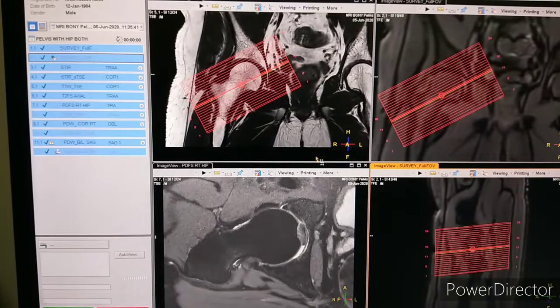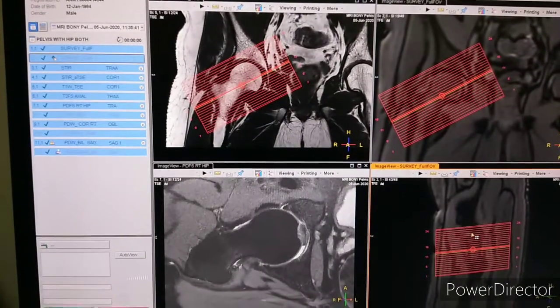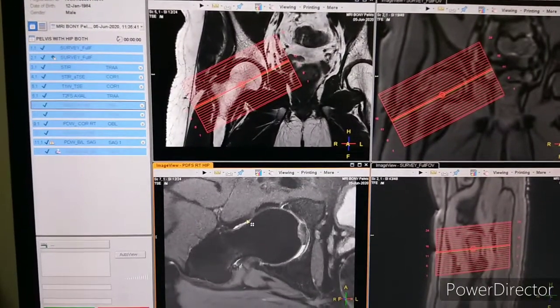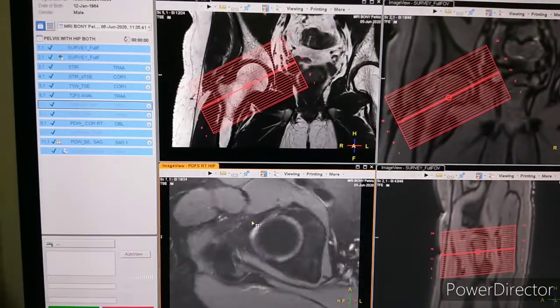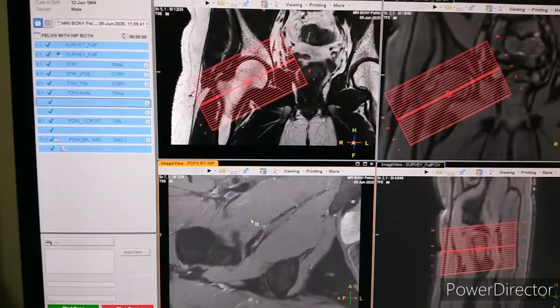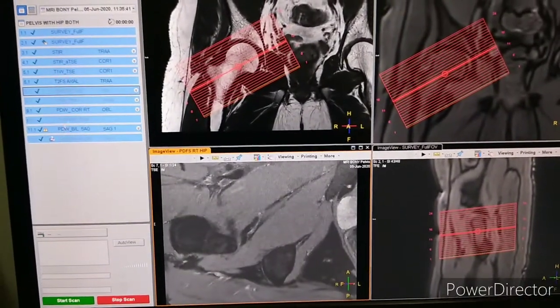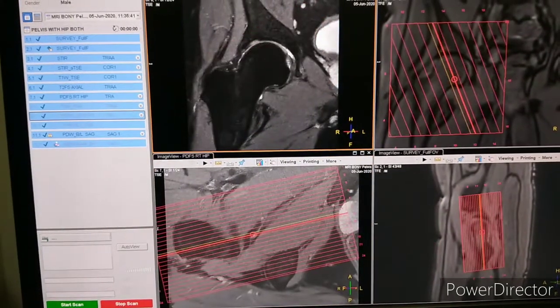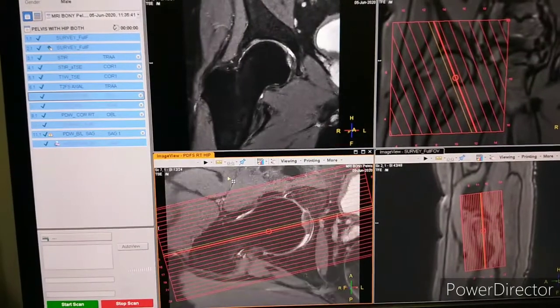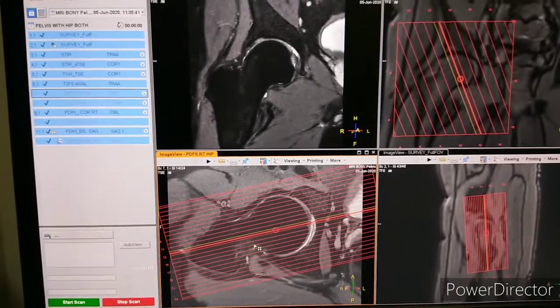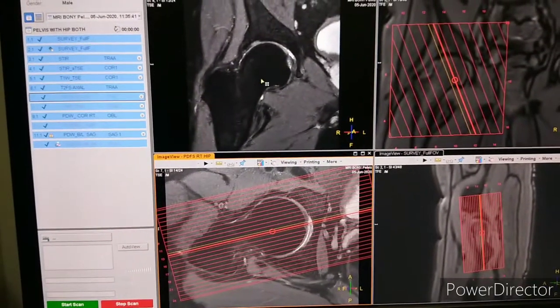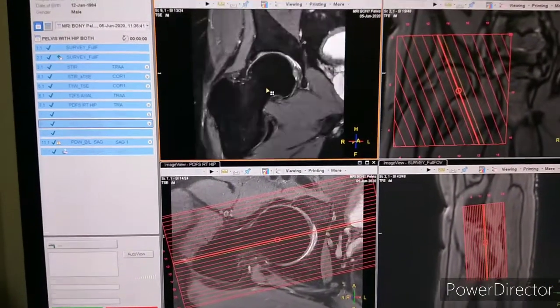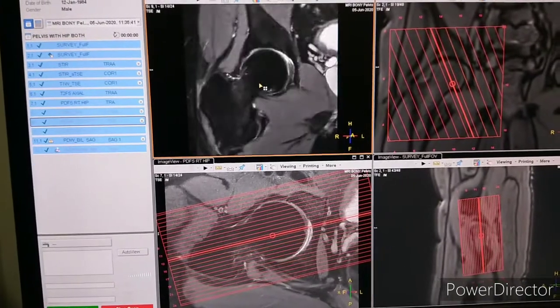Planning on coronal and planning on sagittal as well. After completing oblique axial, you have to acquire oblique coronal. For oblique coronal, you have to acquire PDFS axial first, and after that you can acquire PDFS oblique coronal. You can see the planning here.